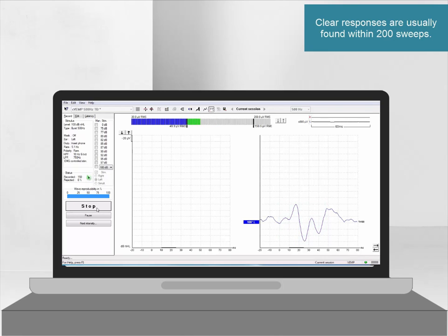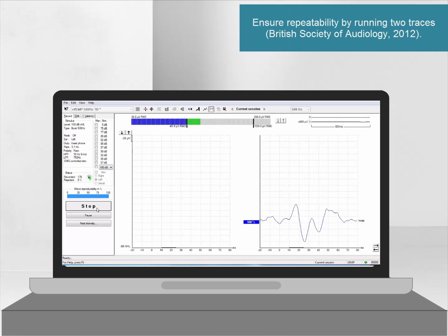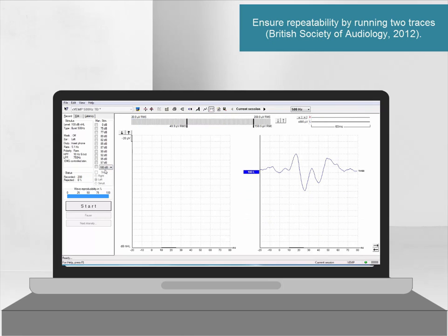In clinical situations we typically stop when a clear response has been recorded. It is always recommended to repeat the C-Vemp to ensure repeatability.